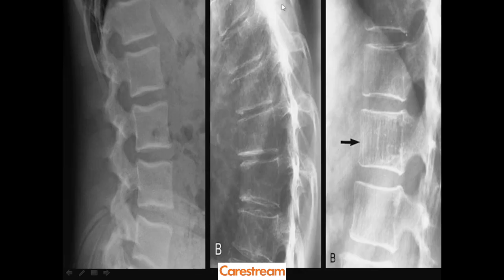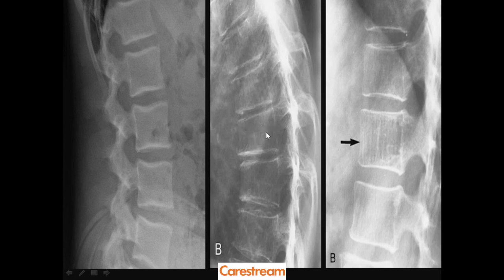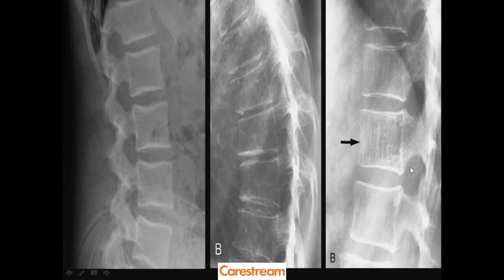Now for the radiographic findings: comparing the patient's radiograph with a normal vertebral body, we see severe osteopenia with increased radiolucency of the bones, pencil thinning of the cortex, and an altered trabecular pattern. The vertical lines standing out in this vertebra show that we are dealing with osteoporotic bone — a loss of bone mass where the quality of bone is fine but the quantity is reduced.